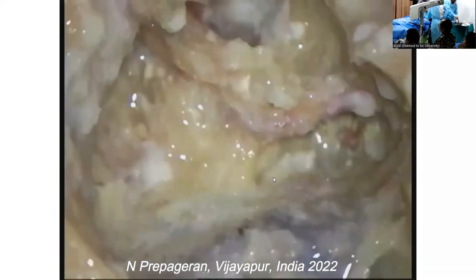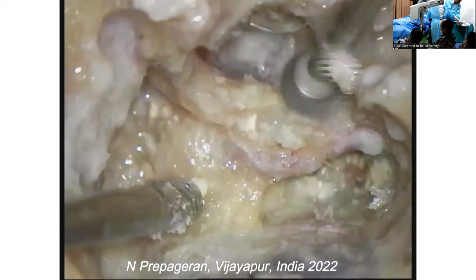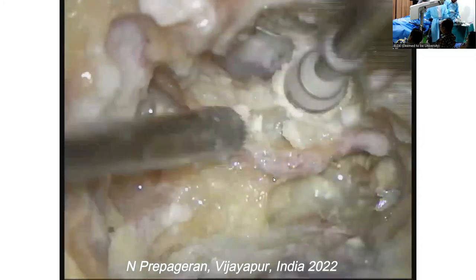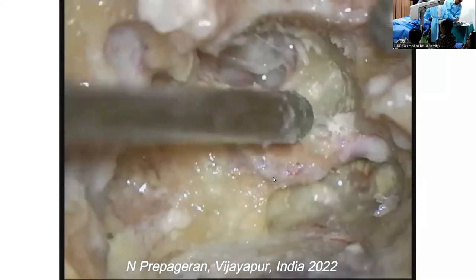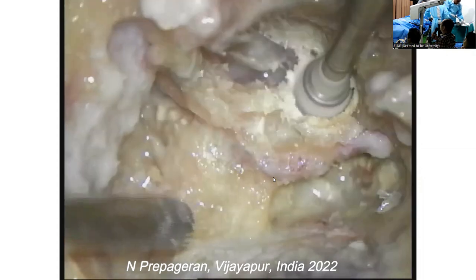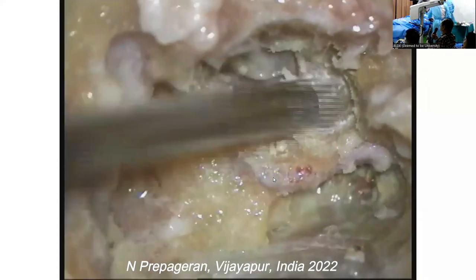Can you hold the head, please? Just hold the head like that. Can you give some water? There. Can you guys see that? Yes, the blue here. That's the jugular bulb. Lots of water.